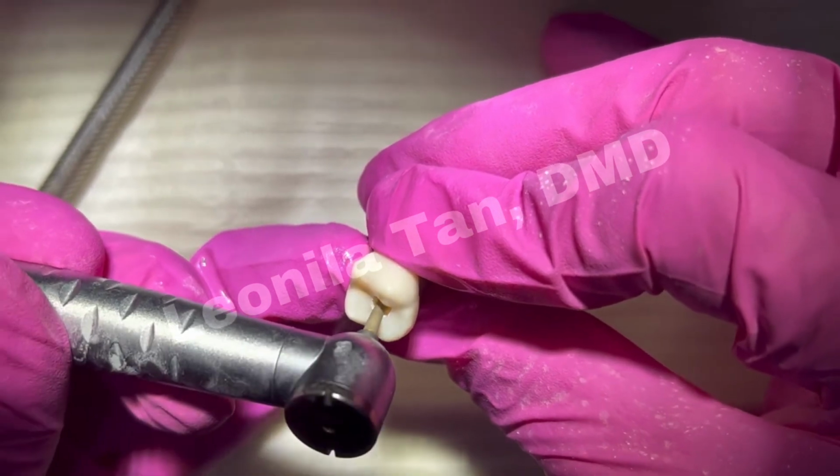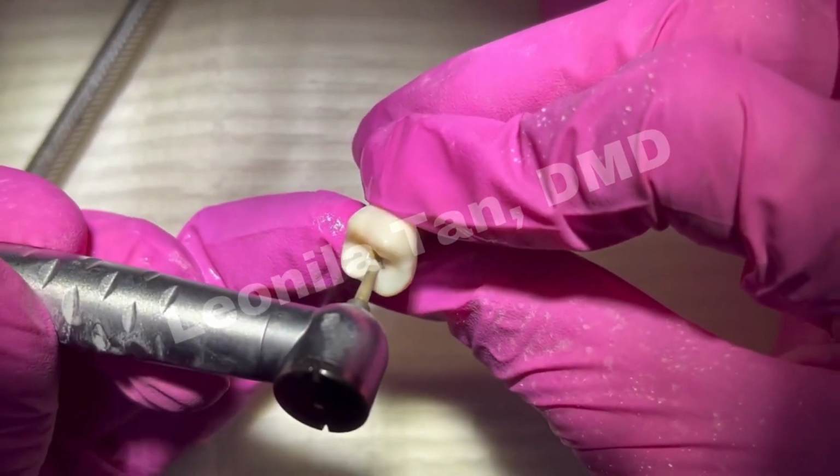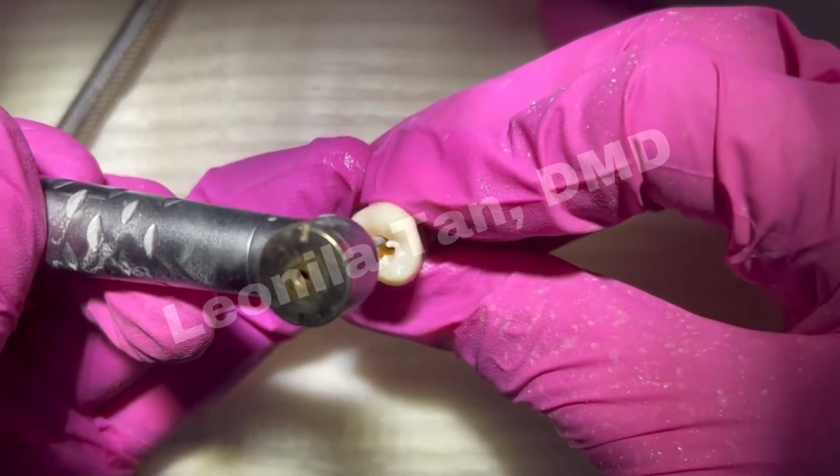So you can use the safe end burr because you know you're going to be safe when you're going near the floor.